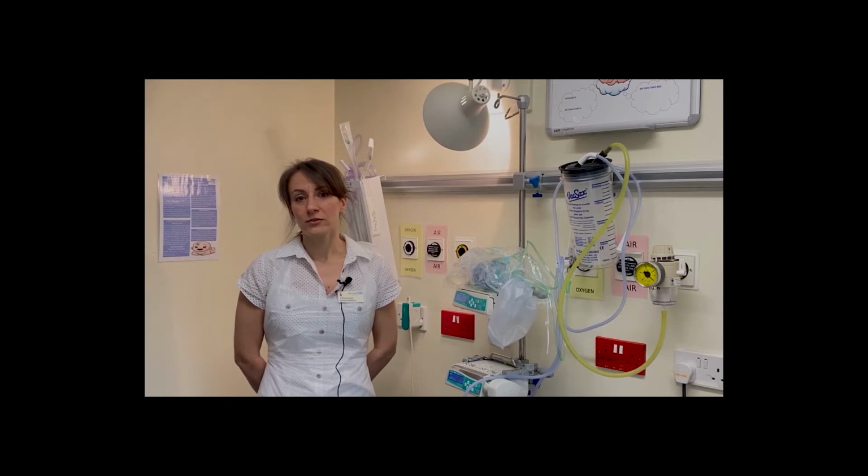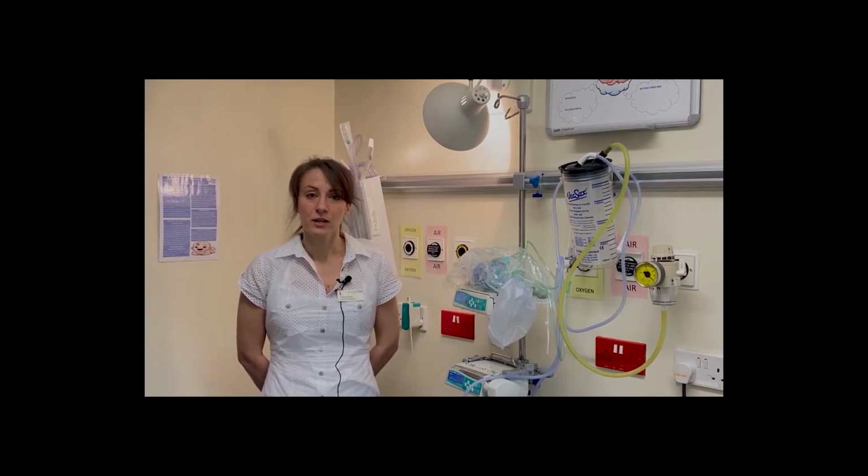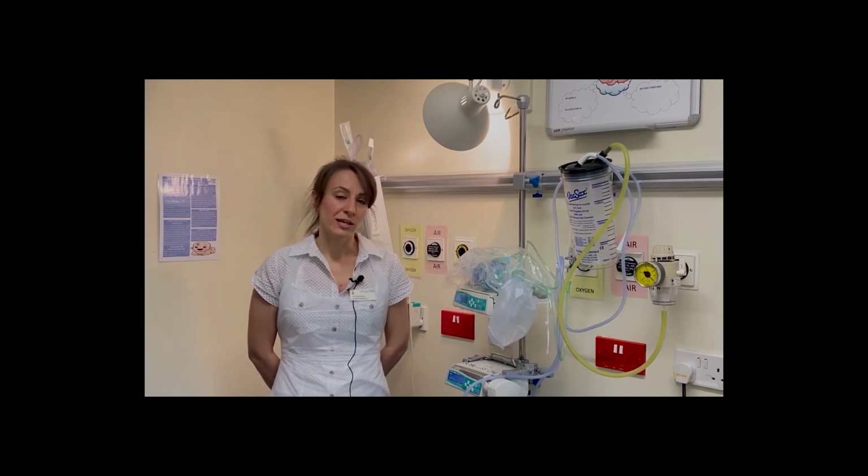Welcome to this practical demonstration on umbilical line insertion. Before gathering and setting out your equipment, there are a few things that you need to do first. To begin with, identify an assistant. Once you are scrubbed and sterile, you won't be able to abandon your sterile field, so it's important that you have an extra pair of hands in case you need anything else.